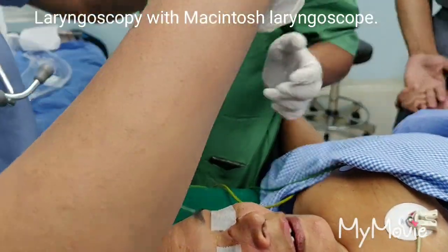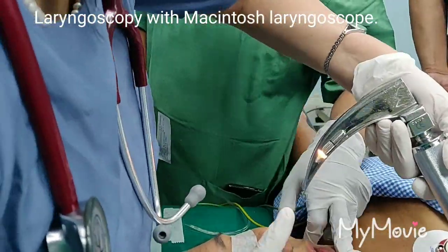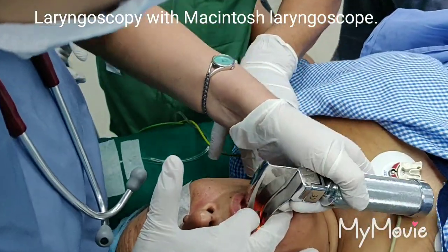Please put the gases off. McIntosh laryngoscope, medium-sized blade.